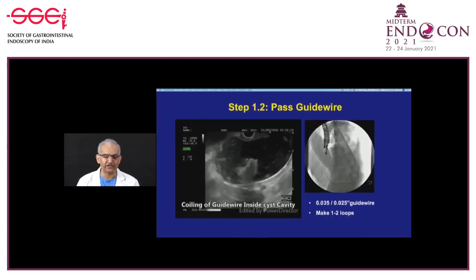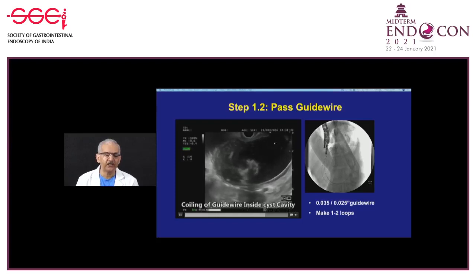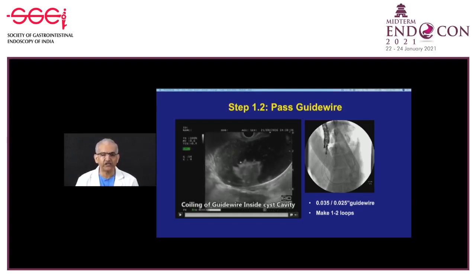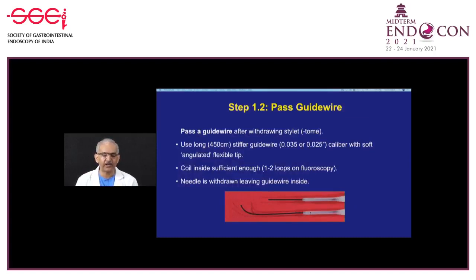After aspirating the fluid, a guide wire is passed inside the collection, which can be seen on EUS coiling nicely. Fluoroscopy can confirm at least two or more coils in a small collection; one coil is sufficient in large collections. Preferred wires are 0.035 or 0.025 inch long guide wires. An angled tip wire is preferred over a straight wire, because a straight wire hitting the opposite wall can perforate it if the wall is immature, whereas an angled tip wire bounces off.